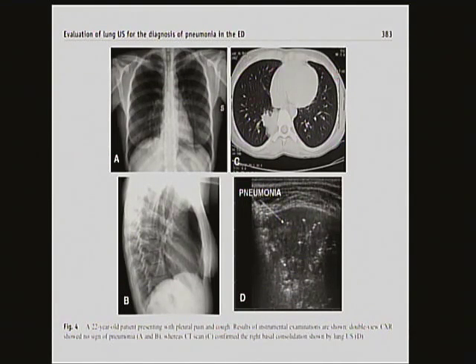The biggest challenge with lung ultrasound, I think, is that it really is a paradigm shift in terms of the clinician being able to trust new findings and use them in replacement of old findings. And the way you get used to that is you do chest X-ray and lung ultrasound for a while and convince yourself that your findings match. And then I think it becomes obvious fairly quickly, honestly, that the lung ultrasound gives you more data than the chest X-ray.